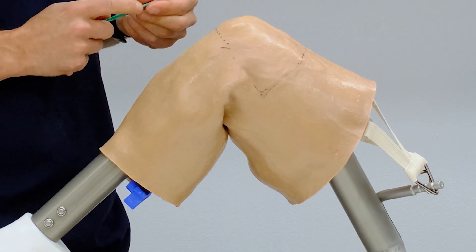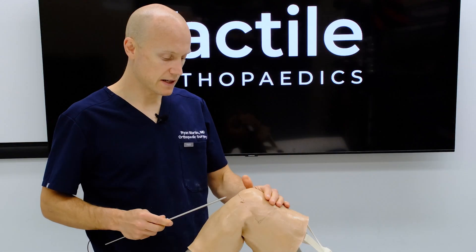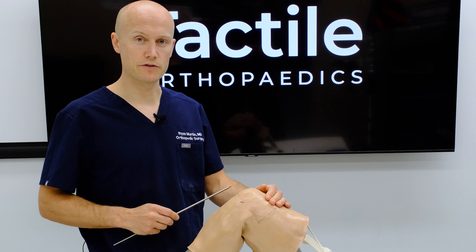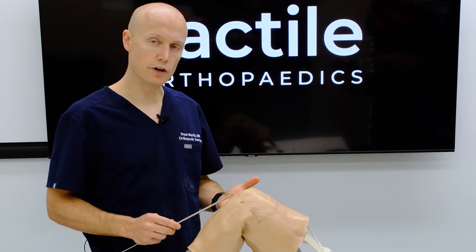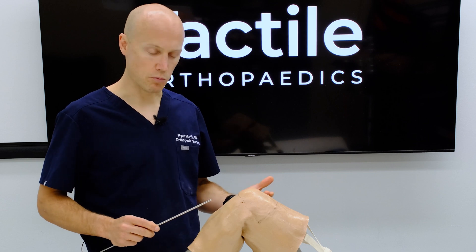What we'll do is start by accessing the joint. Gaining access to the joint, I've stayed high anterolateral. It does teach trainees who are a little bit more junior the benefit of staying outside the fat pad when placing our portals.